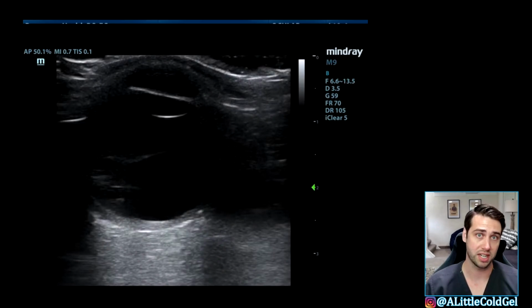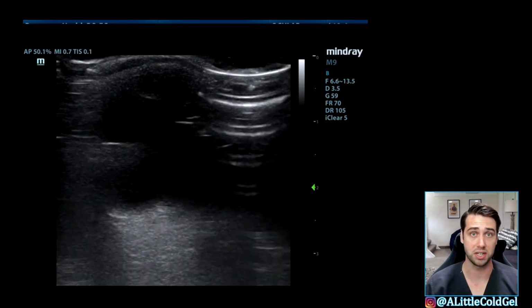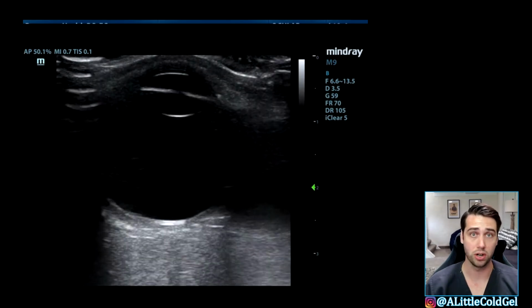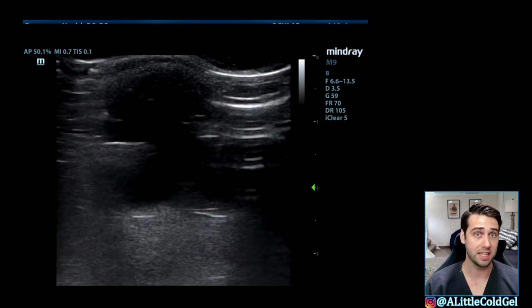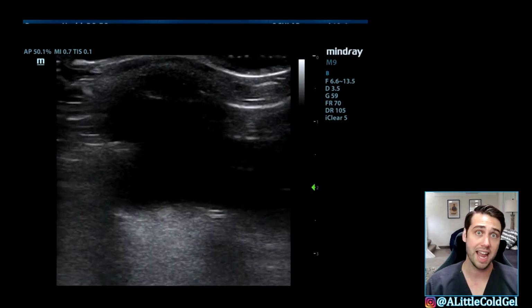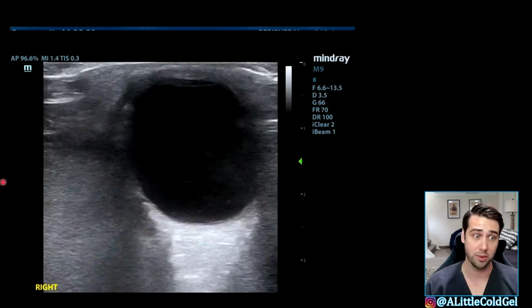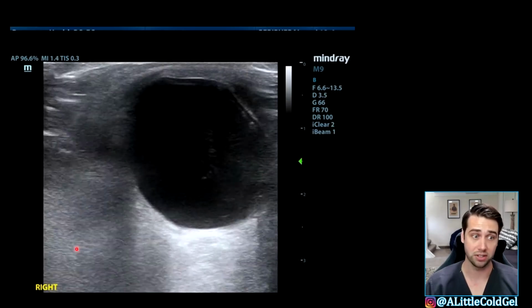Now, after you've kind of fully evaluated the retina, the next thing you want to do is check that posterior segment for any sort of hyperechoic material that could represent a posterior vitreous detachment or a vitreous hemorrhage. So the key in not missing anything here is having the patient move the eye and slowly increasing the gain. So you see in this clip, the gain is fairly high. We have a lot of extra gain out here on the sides.